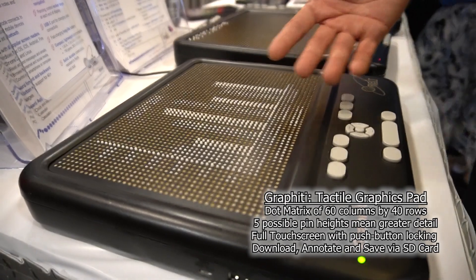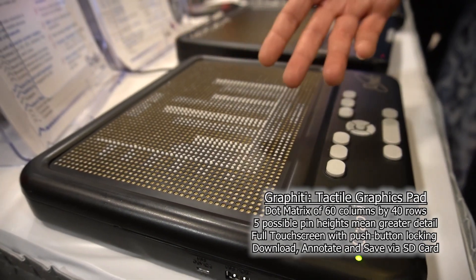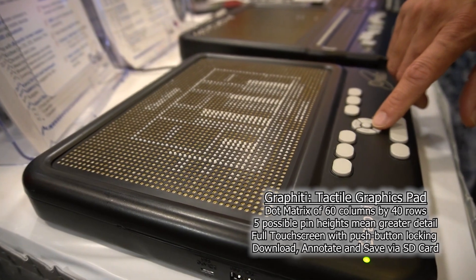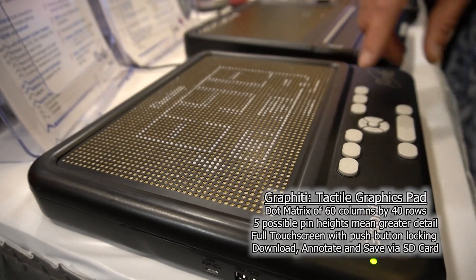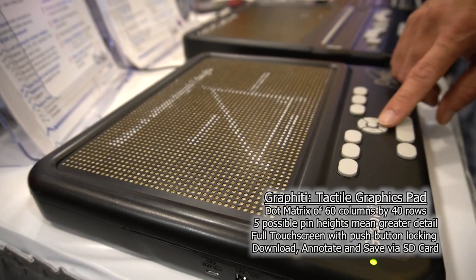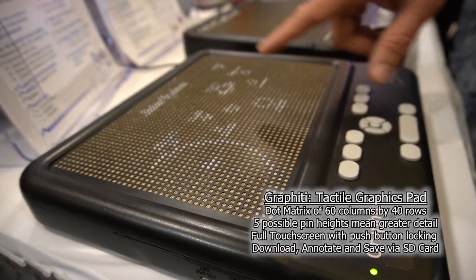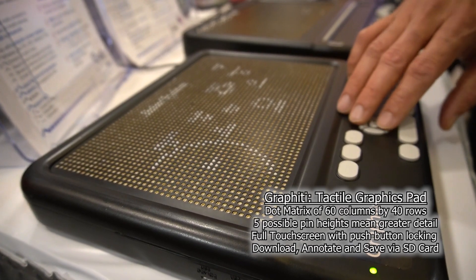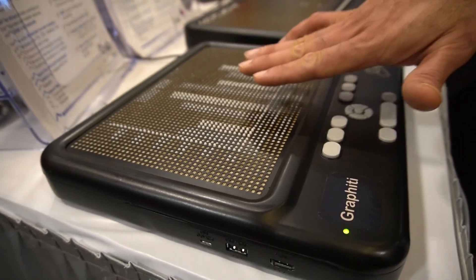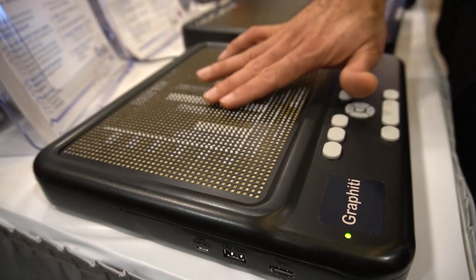This is now showing a picture that is saved onto an SD card — a chart we downloaded from the internet. I've got several stored. I'm just going to scroll through them — this is a floor plan, the next one is a triangle, and this is a picture of the solar system. You can also see the different levels of heights here, which represent different colors in the original bar chart.